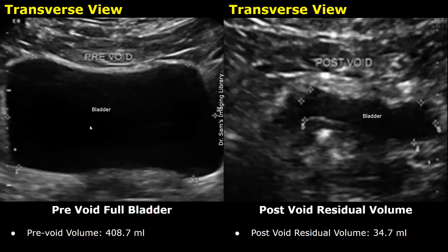This is an example of a normal post-void residual volume. The image on the left shows a pre-void full bladder with a pre-void volume of 408.7 milliliters. The image on the right shows the bladder after urination — it appears smaller. The post-void residual volume was 34.7 milliliters. You can easily see a small bladder.